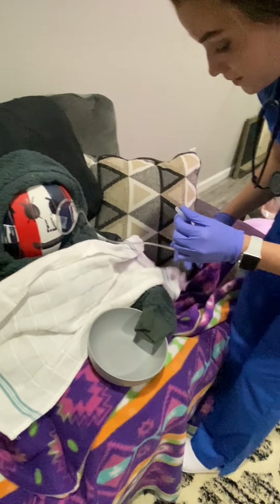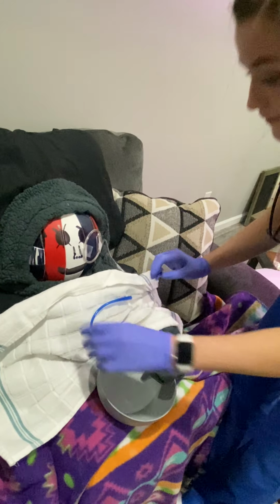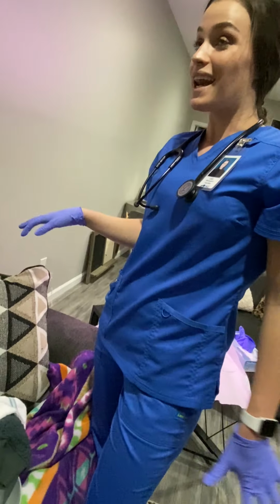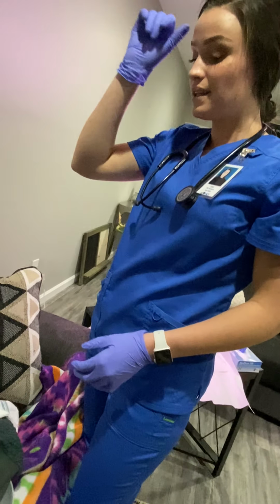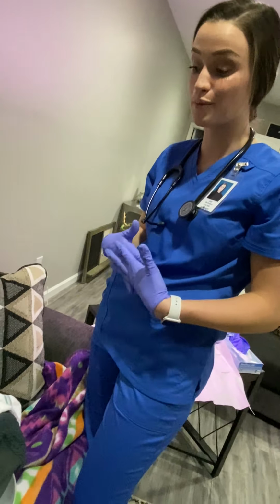And then I would do whatever I needed to do with this NG tube according to the physician's order, whether it be feeding or suctioning. And I would follow the rate that the physician ordered. I would place the patient in a position where he or she is comfortable.